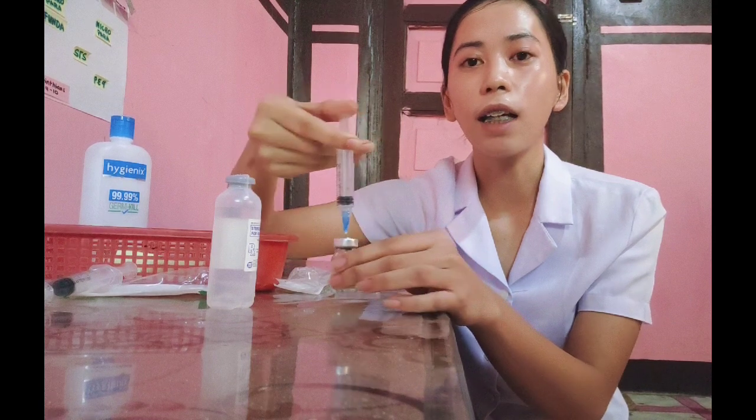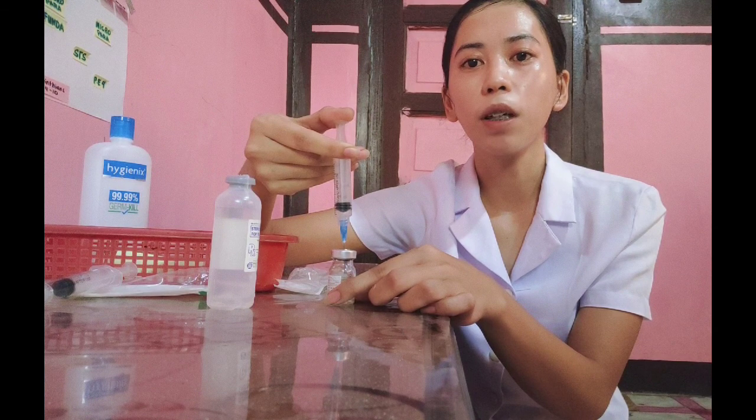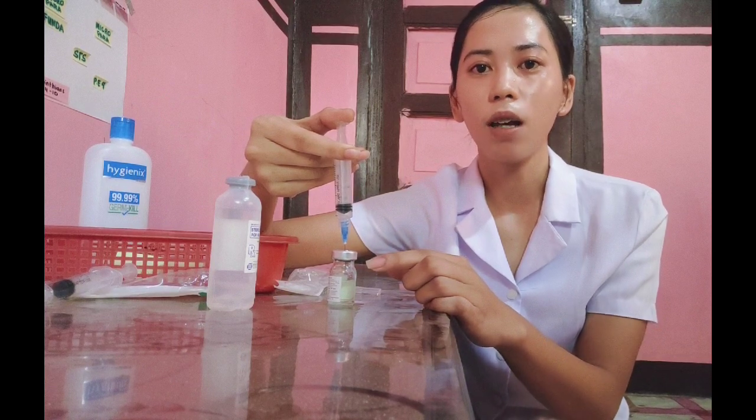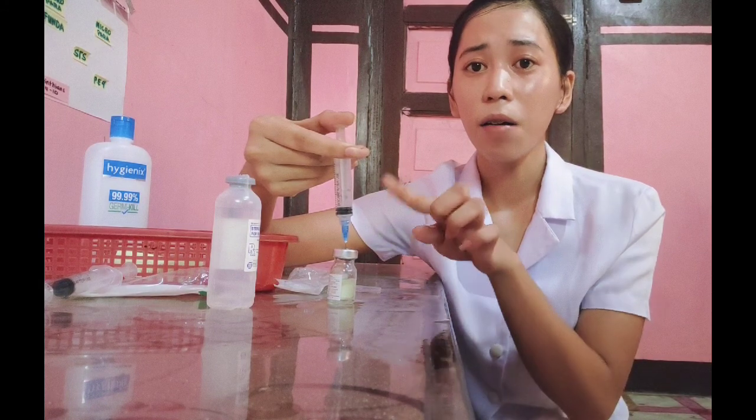The rationale is the air will allow the medication to be drawn out easily because negative pressure will not be created inside the vial.